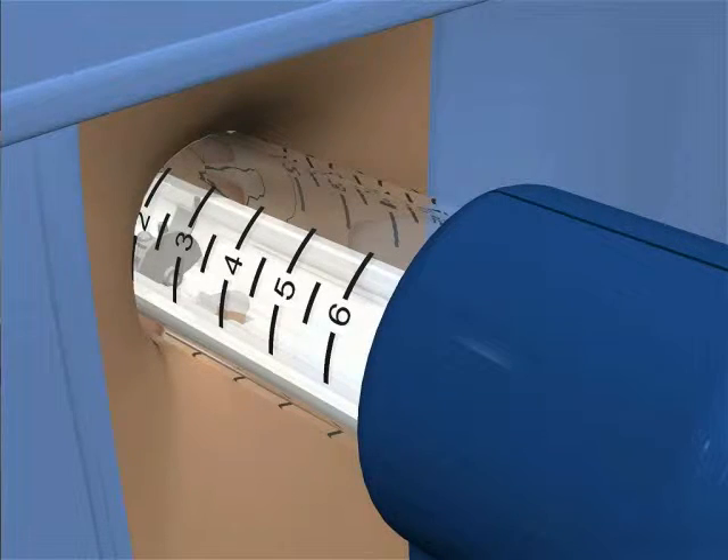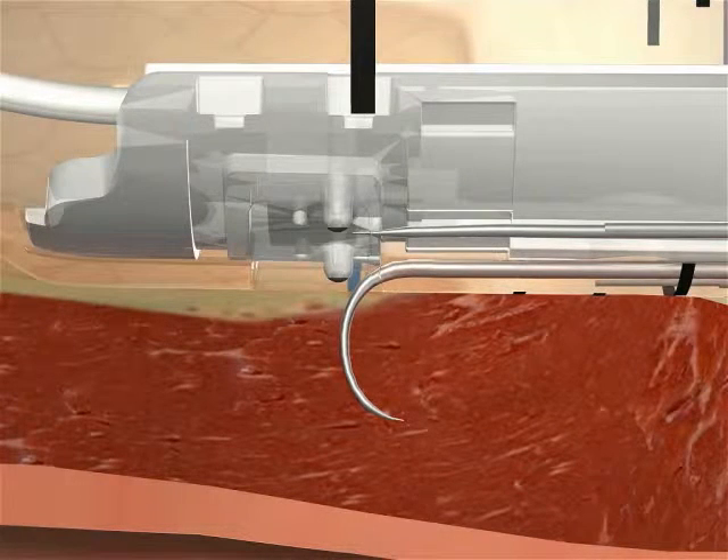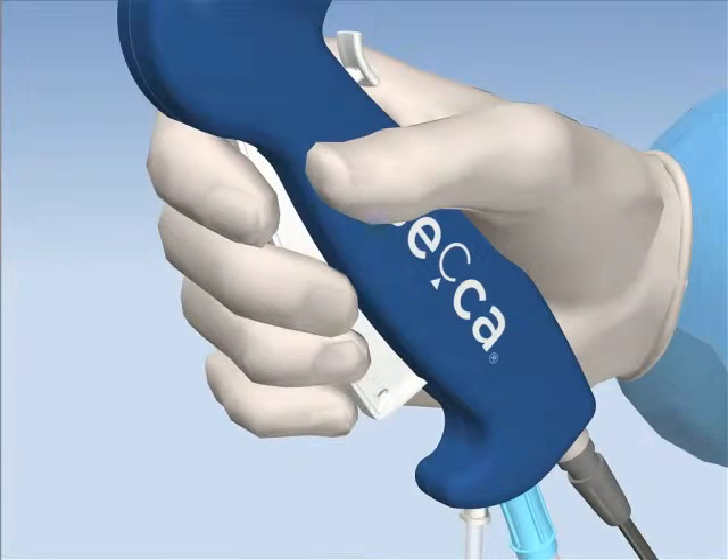Extend the needles. While holding the handpiece firmly against the rectal wall in the proposed treatment quadrant, squeeze the trigger to extend the needles on the Secca handpiece. This will help achieve optimal impedance levels. While applying pressure, squeeze the trigger until an audible click is heard. That signifies that the needles are locked in the extended position. It is not necessary to maintain squeeze pressure on the trigger once the needles are extended and locked.